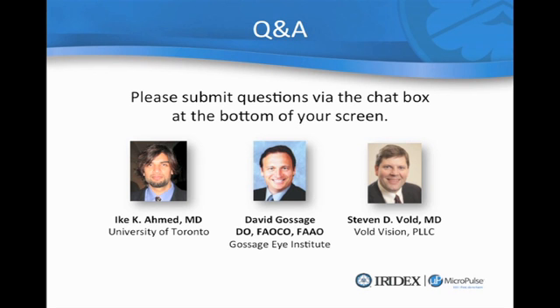And the other thing too is, not only the compliance issue, but if we can keep the pressure controlled and keep it consistently controlled, as you know, with medications, you're always going to have pressure that will go up and down throughout the day when the medication starts to wear off. And with the laser trabeculoplasty, I think you get a better, even pressure throughout the time period too. So from my standpoint, I probably opt a little bit more today using laser therapy first versus medications.